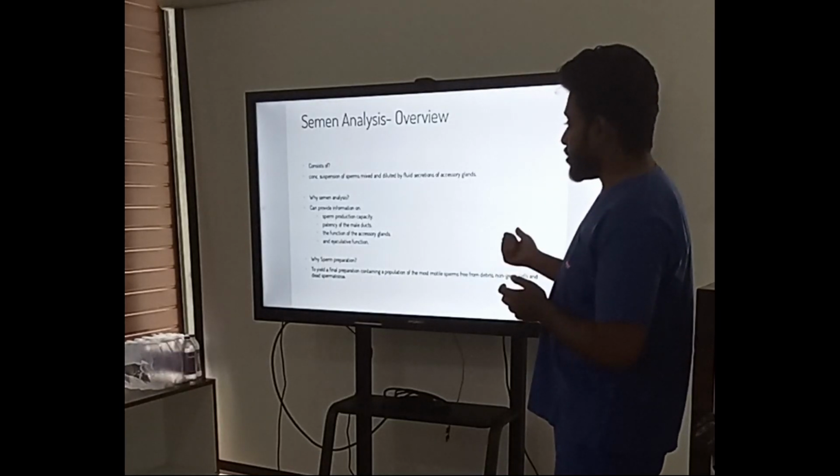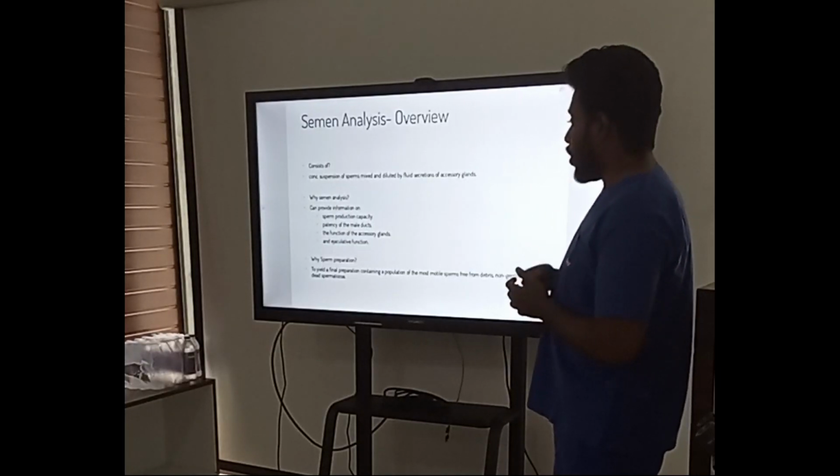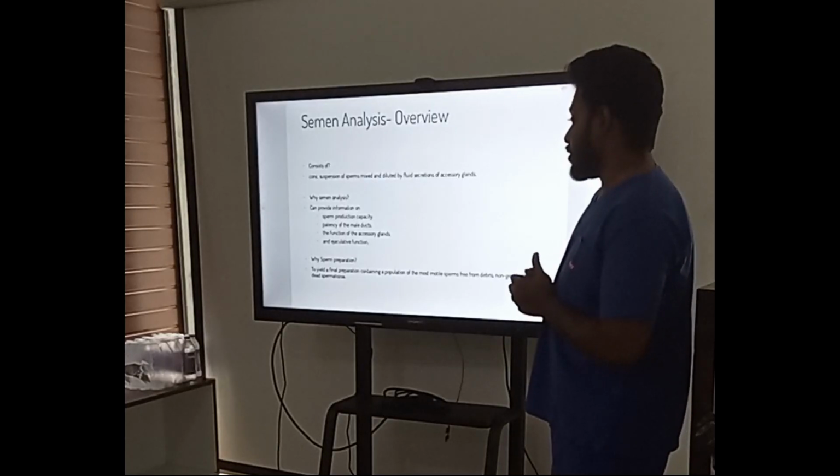So why semen analysis? As we all know, we are going to treat infertility patients. It can provide information on the sperm production capacity, the patency of the male duct, the function of the accessory glands, and ejaculatory function. So why is sperm preparation needed?